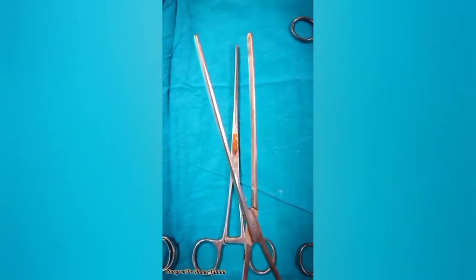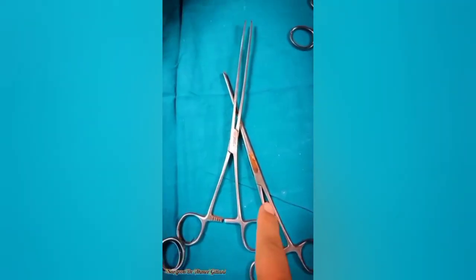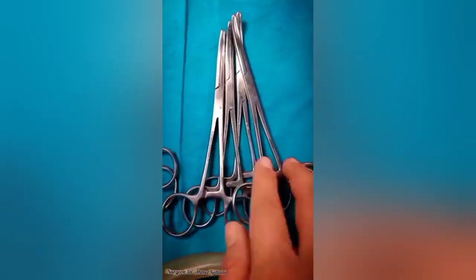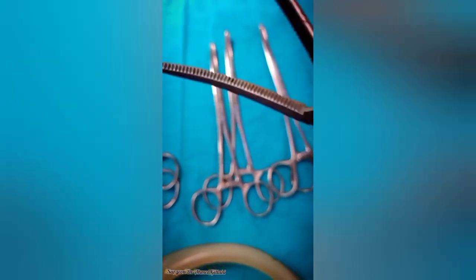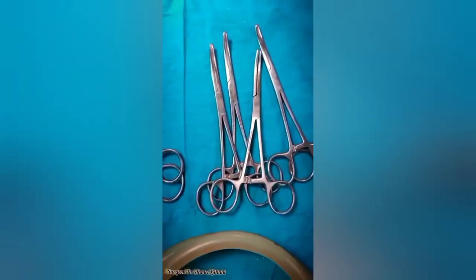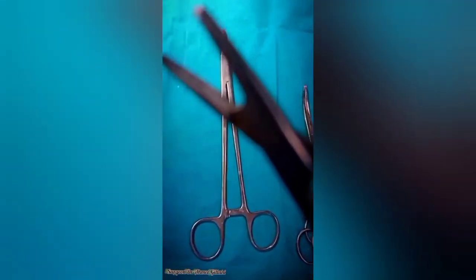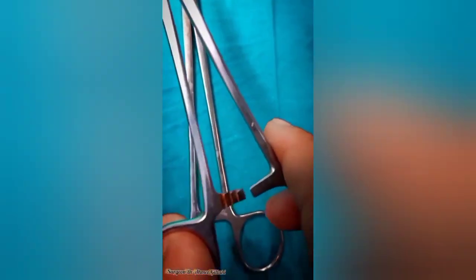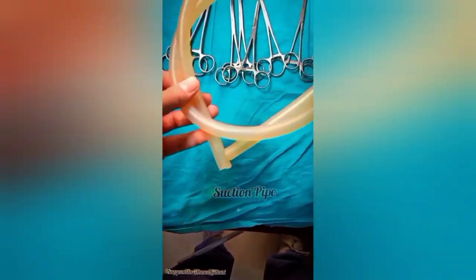Now we have the non-crushing intestinal clamp. In close-up view you can clearly see the horizontal lines on its ends; it is used in resection and anastomosis. Next are the artery forceps, used for controlling bleeding and dissection of tissues. Also known as hemostatic forceps, they block blood flow and close blood vessels. On screen you are seeing the needle holder, used to hold the needle while suturing in different layers of the body. It has a groove on the internal surface, and the locking and interlocking mechanism can be visualized. Lastly, the suction pipe, which is sterilized and included in the laparotomy set.